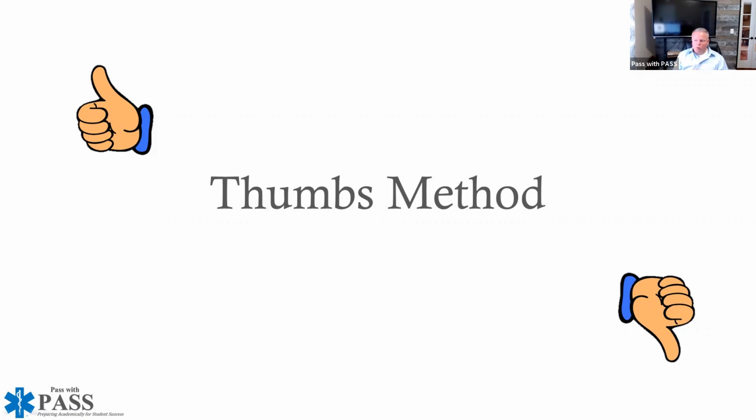So question real quick, can lead placement affect axis? And the answer to that is absolutely, especially if your leads are on inappropriately, for instance if you have your right and left limb leads reversed. Then yes, it could definitely affect axis. The flow of the electrical impulse towards the heart should obviously not be affected. So if the left ventricle is requiring the most amount of energy, then the energy is going to go to the left.